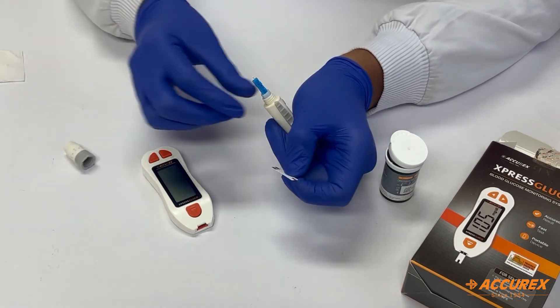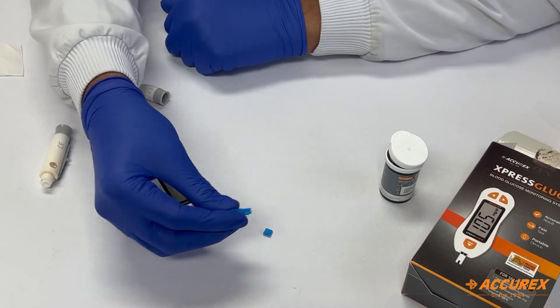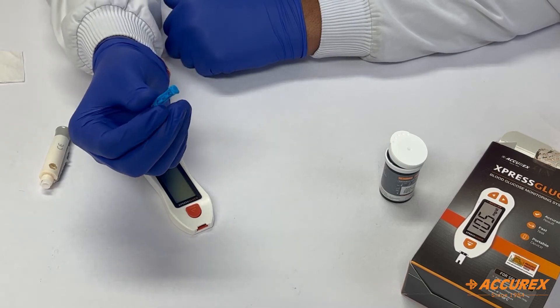Take the cap of the lancet and insert the needle into the cap, then throw it in the dustbin as a preventive measure. Insert the needle into the cap and discard it safely in the dustbin.